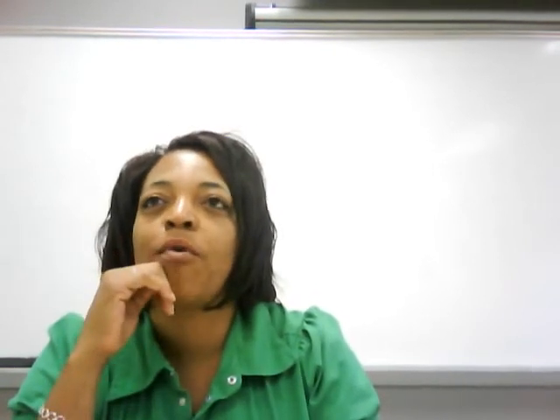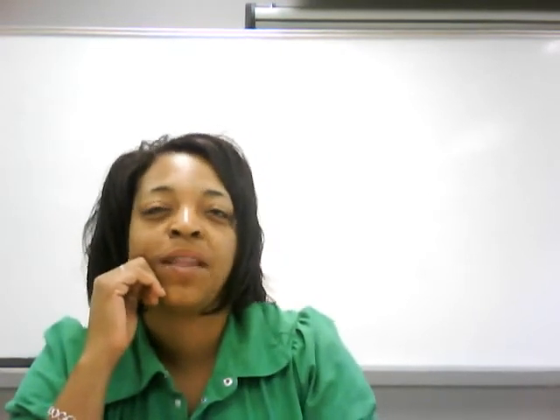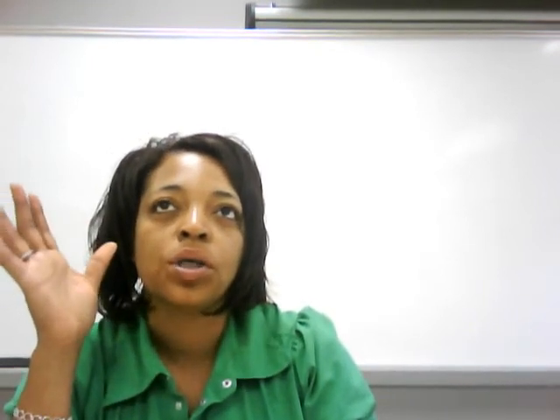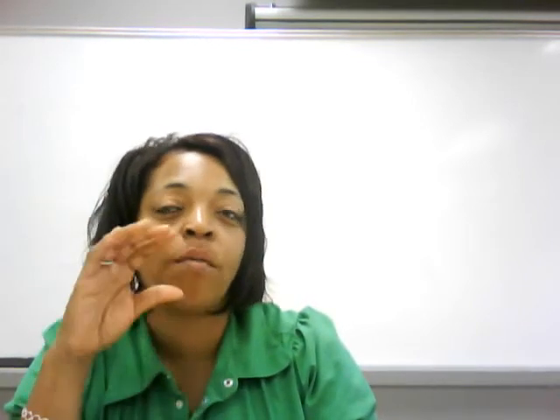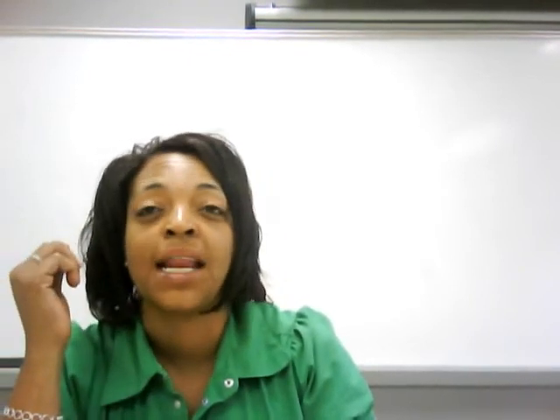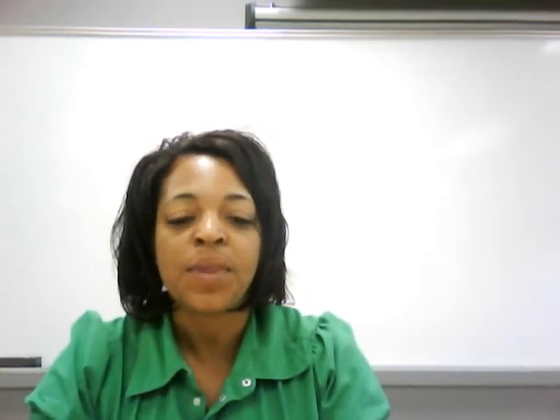Well, this will probably represent what we call distortion. And distortion could be something that makes a picture or an object look smaller or larger, most of the time larger than it actually is, or if it makes it look longer, where it's actually a little bit shorter in actual life if you're looking at it with your naked eye. That'll give you an idea of what distortion is.